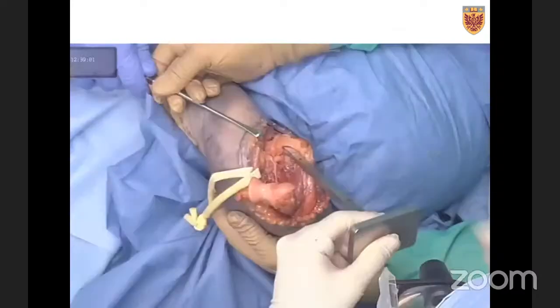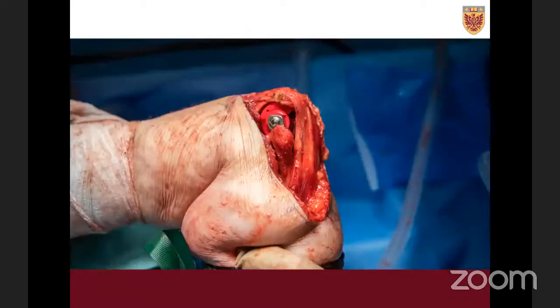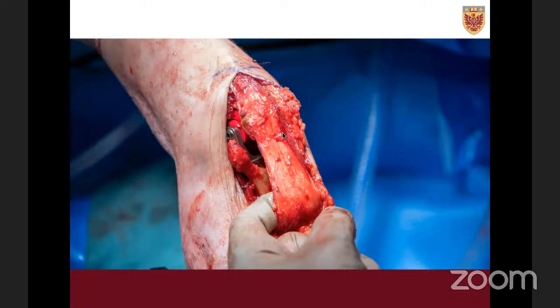Here's some preparation of the ulna — you can see the triceps tendon has not been violated except for the very small sliver taken off, which really contributes nothing to the triceps. The trial implants go in and then the real implants are reduced. Here's a picture of your triceps tendon insertion — literally not violated whatsoever with this approach. There is really no concern for triceps insufficiency, weakness, or failure with this technique.